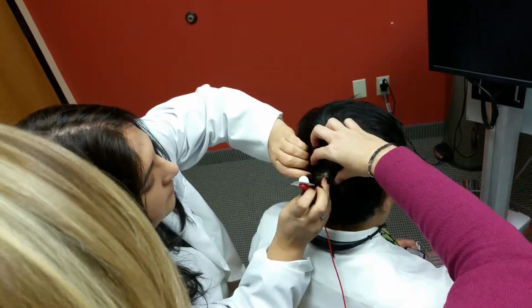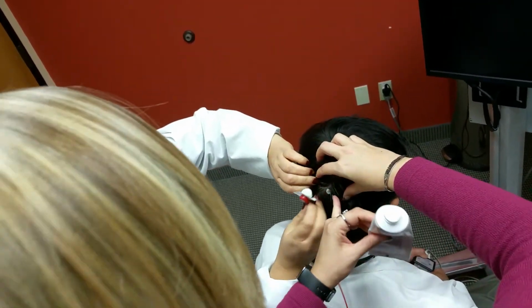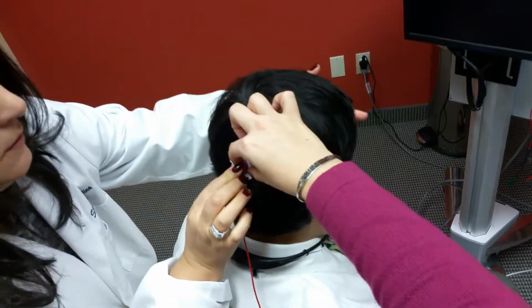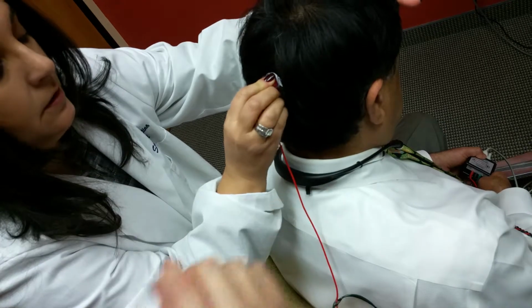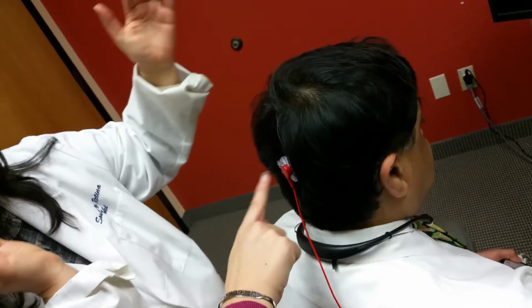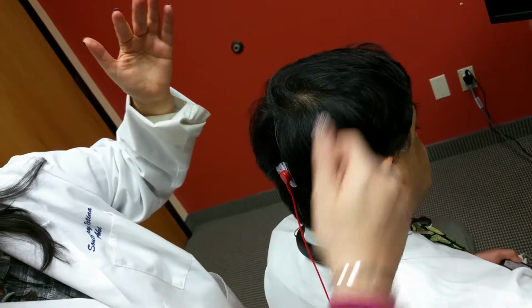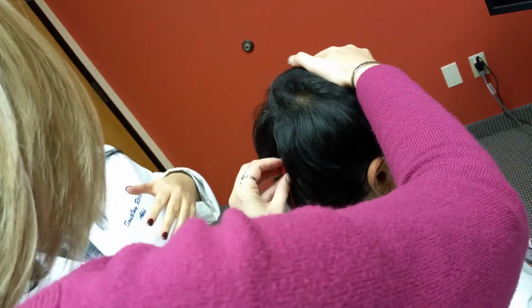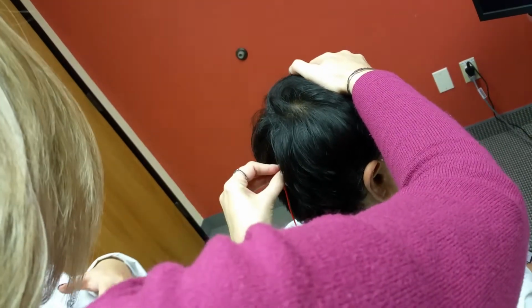Look straight ahead. So you want to make sure that you get as much hair out of the way as possible, because we want to be as close to his scalp as possible. You're going to put this exactly, don't move that because that's where we're going to go. Yep, and then all five fingers around, we want to press here, we don't want to press on that button. So it should actually be more of a cone shape than completely flat. You see how it kind of presses out? We just want to make sure that we wiggle it in just a little bit more. If we lift it and the hair comes with it, we know that we don't have a really good connection. That's what we want.